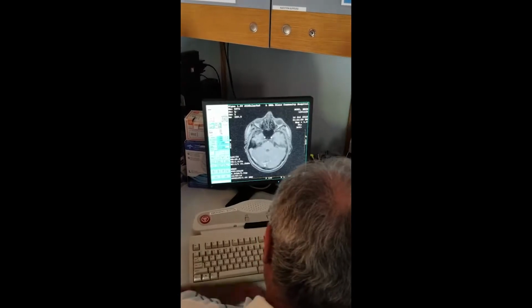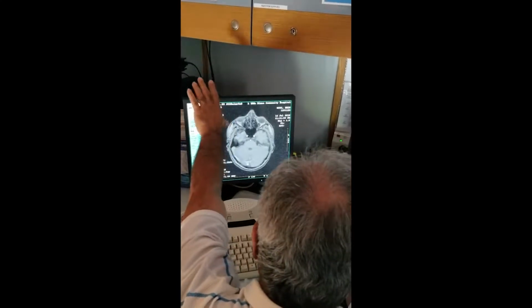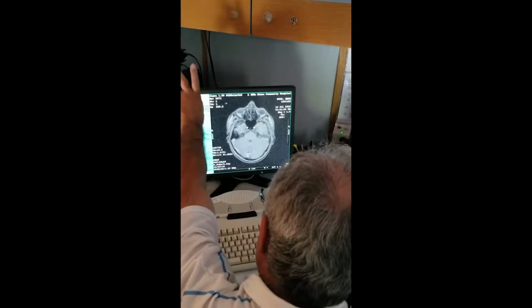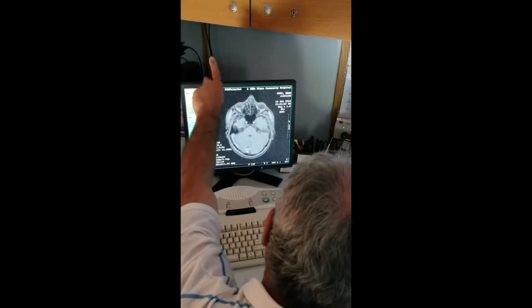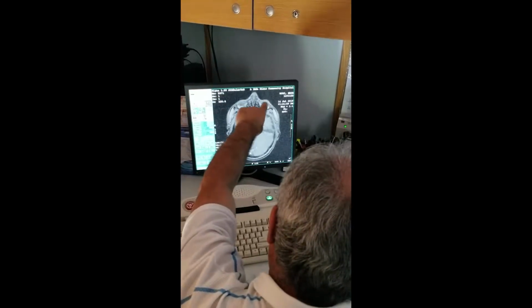Okay? Alright. So this is a Signa 1.5T. It's a system number. What are we? San Dimas. This is the number. Sequence 1, image 1, axial. Inferiorly, we are at 20. We don't care. That's his number. This is the date. This is the time. Mag at 1. If I do this, it's going to say mag 1.1.